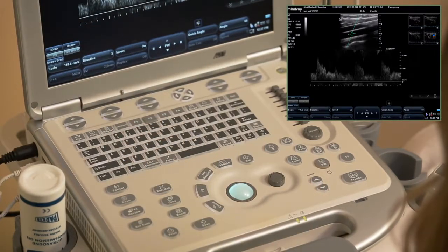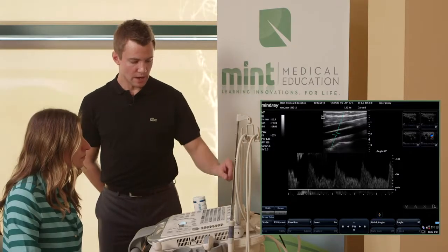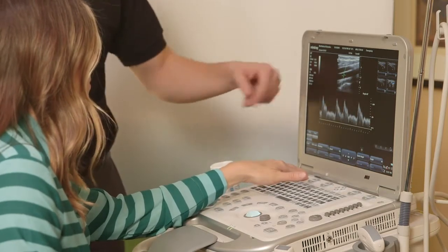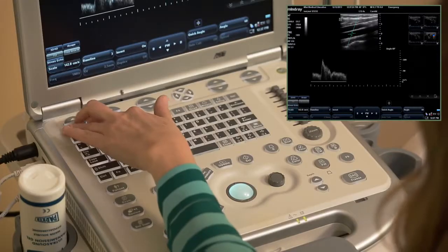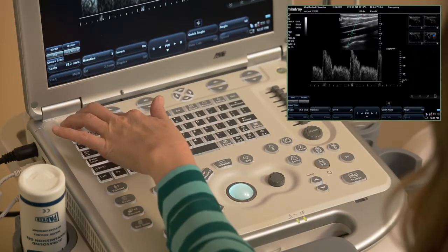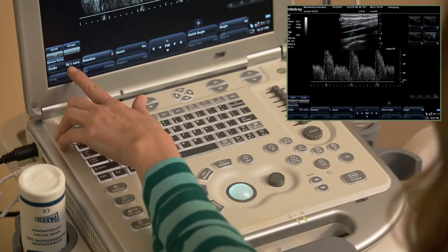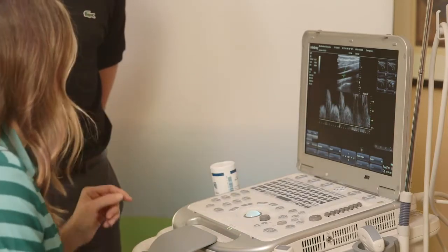And similar to the color Doppler that we talked about, you do have a scale where you want to make sure that your velocities are matching the type of waveforms and flow patterns of the vessels that you're looking at. I think this is good for people that are not used to using systems, not sonographers maybe, or other users that are newer to ultrasound, that you really want to be aware of this number and this number because you're going to miss a lot of that.